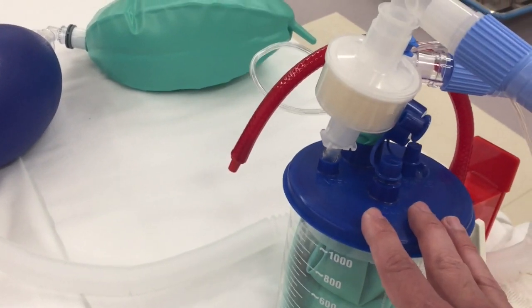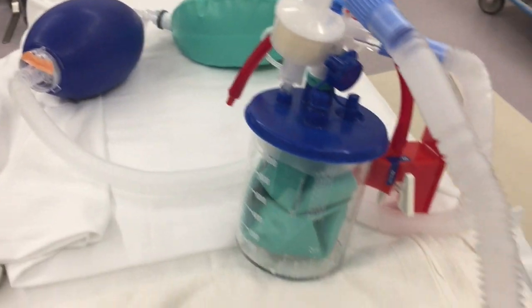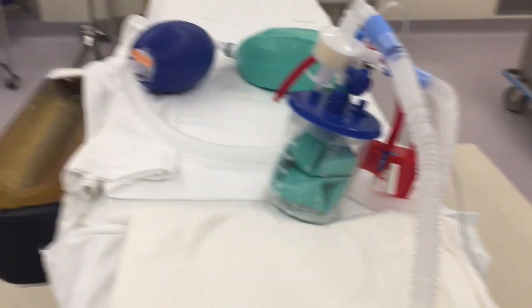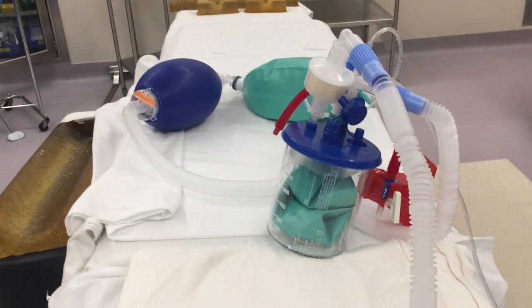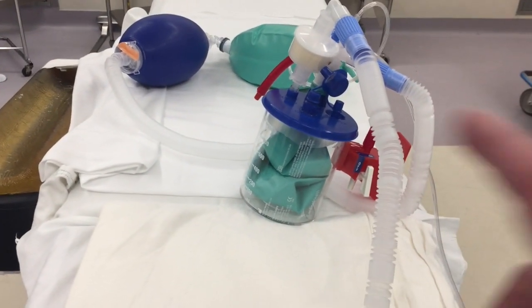This is a more updated design which allows you to use common hospital components to ventilate multiple patients — four or five patients — using a single ventilator. And in a time of crisis, this could be really helpful because each patient can have their own circuit with their own minute ventilation.